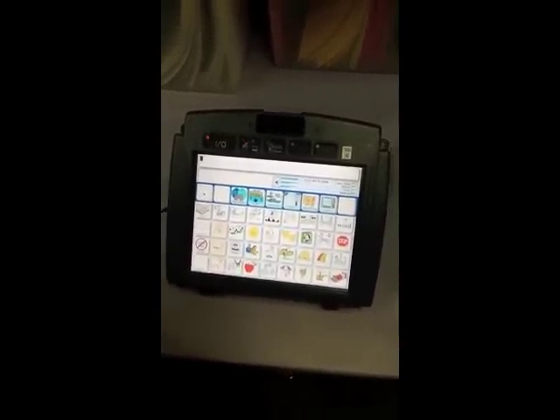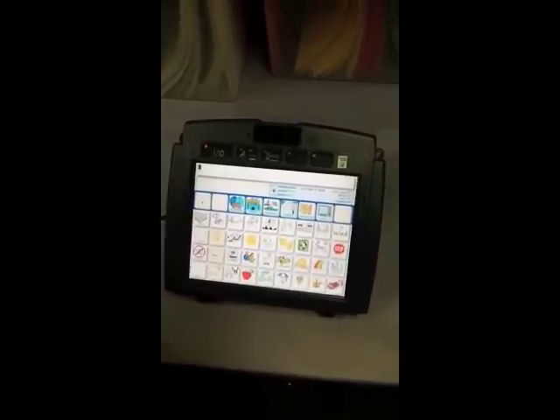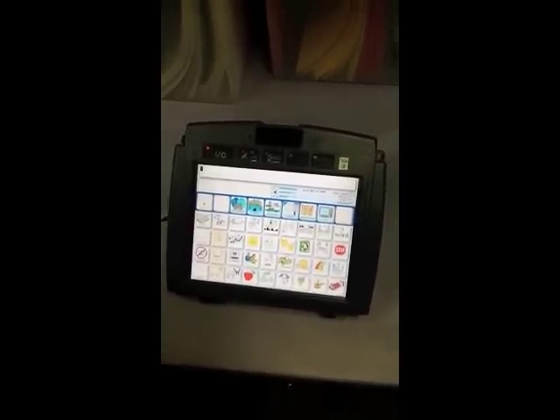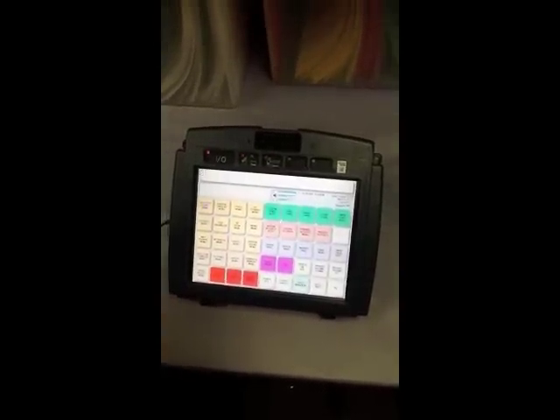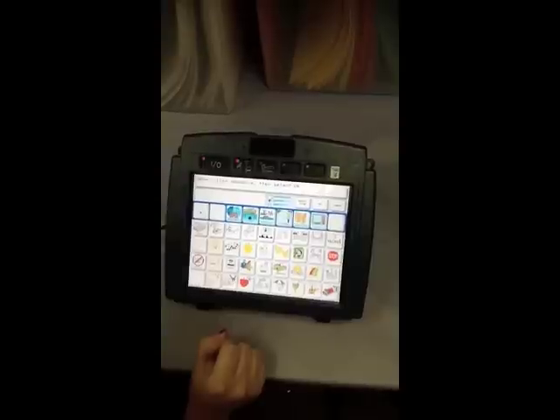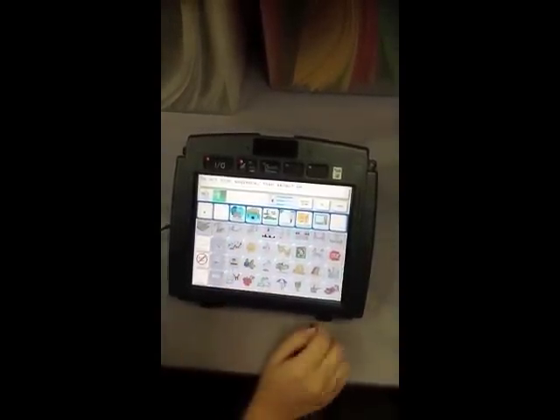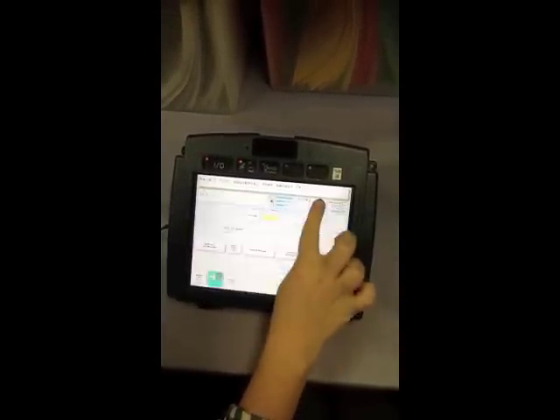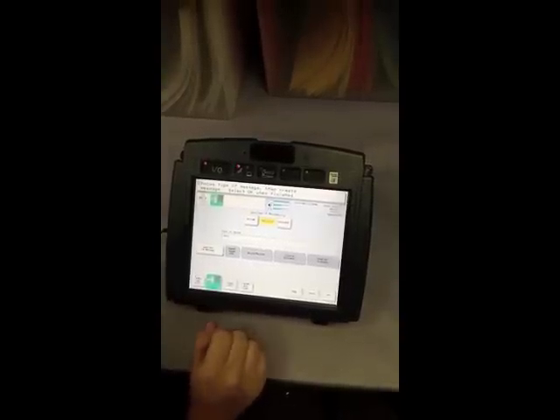To record one's own speech into digitized speech, there are many different steps. The first step is to decide what you want to say and the icon sequence you want to use. After doing this, open the toolbox. Once you are looking at the toolbox, activate the Store Core key and the icon sequence you would like to use. After this, press OK. Then activate the type of message until you see the word recorded.